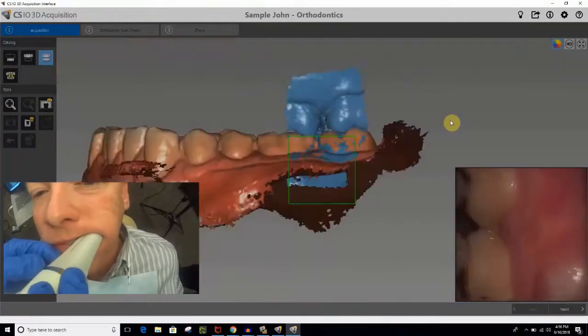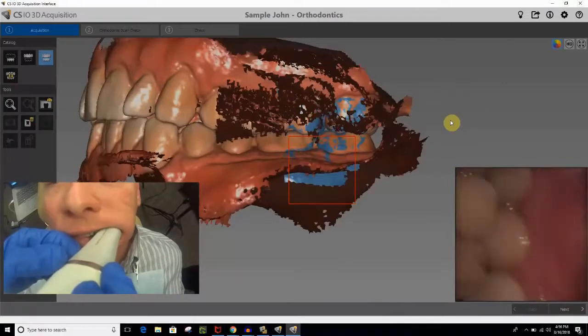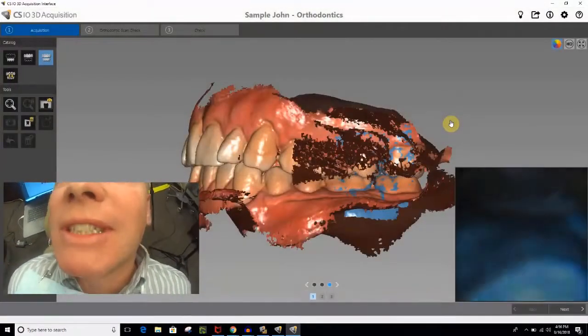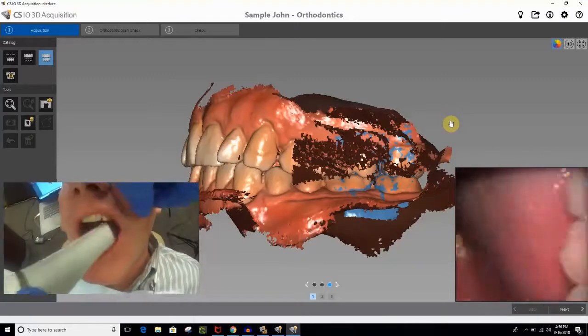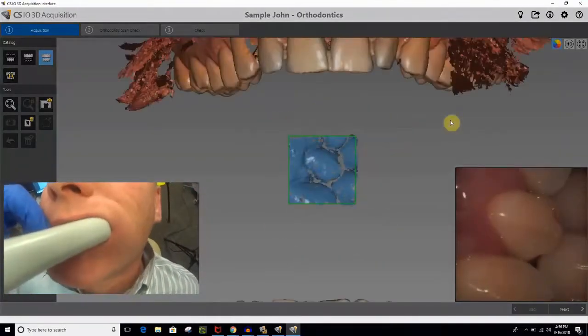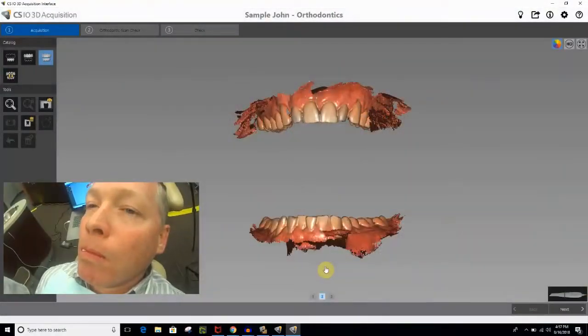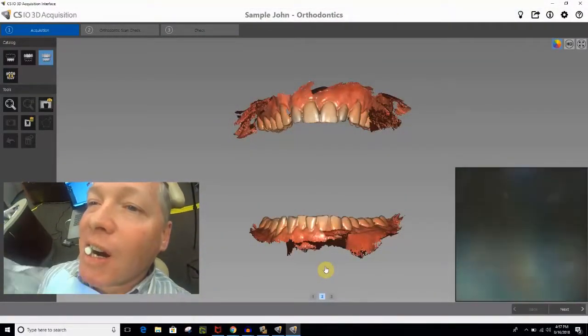Once the bite has been registered, you can rotate and zoom the view to ensure that the bite is accurate. Select a dot to show the bite for that capture. Select a dot and delete it if the bite is mismatched, and then follow the scanning procedure to recapture the buccal bite image.